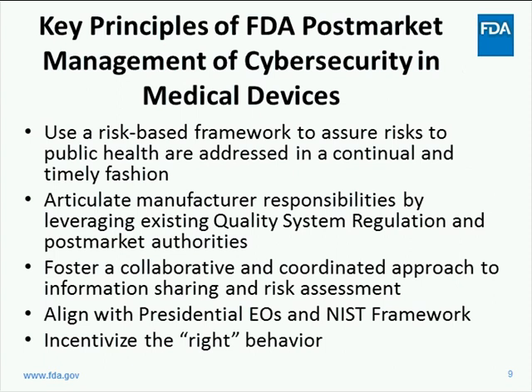Because vulnerabilities will continue to evolve, pre-market controls alone are not sufficient to manage cybersecurity of devices through their lifespan. We have therefore put forward policy for managing the cybersecurity of devices in distribution. The key principles are: number one, use a risk-based framework to assure that risks to public health are addressed in a continual and timely fashion.